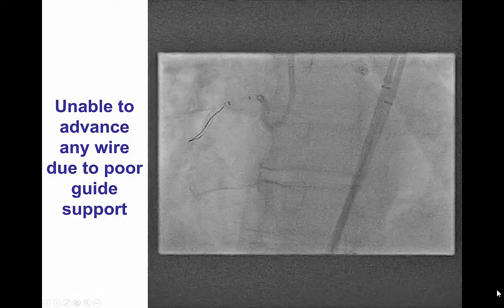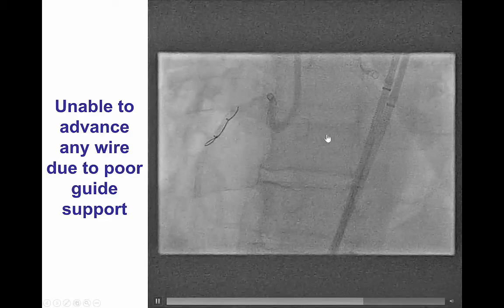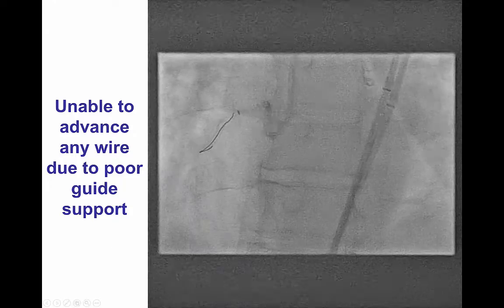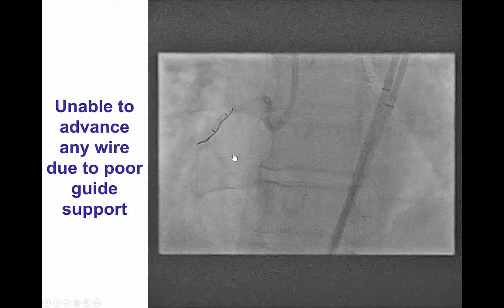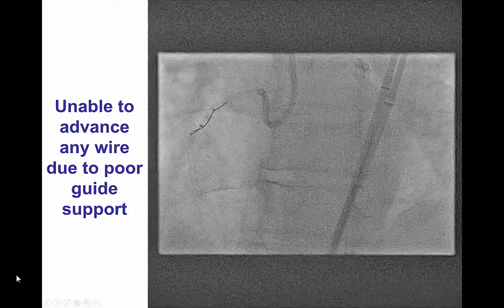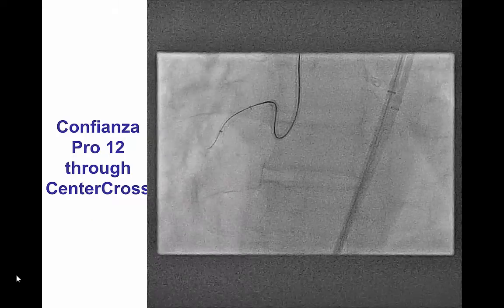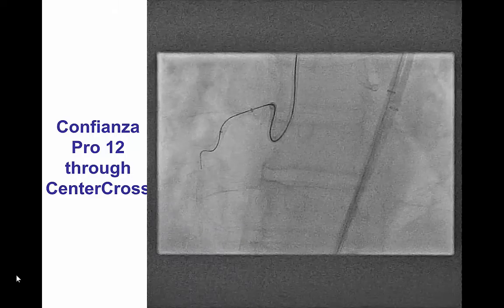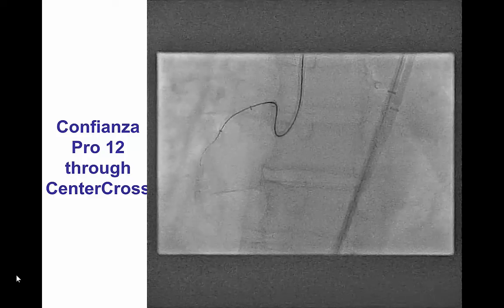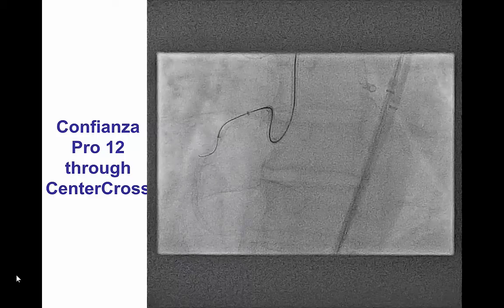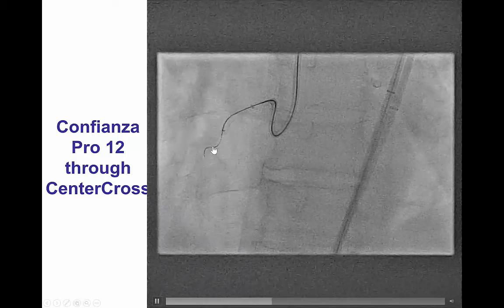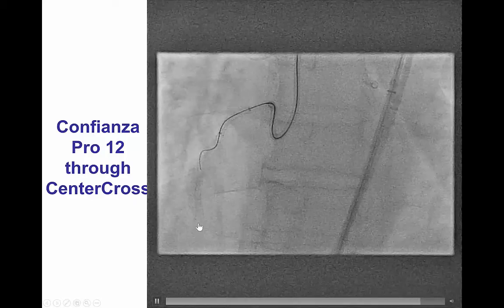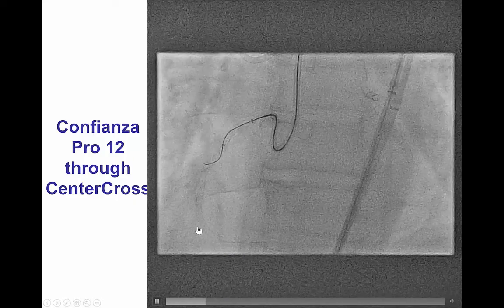We had significant difficulty advancing any wire past the proximal cap due to poor guide support, despite having an 8 French Amplatz 1 guide catheter and long 45 cm sheaths. We were, however, able to advance a CenterCross support microcatheter into the proximal right coronary artery, and this provided excellent support that enabled advancement of a Confianza Pro-12 wire through the proximal cap, which appeared to be very hard and difficult to penetrate.